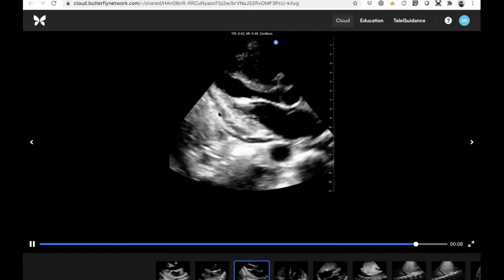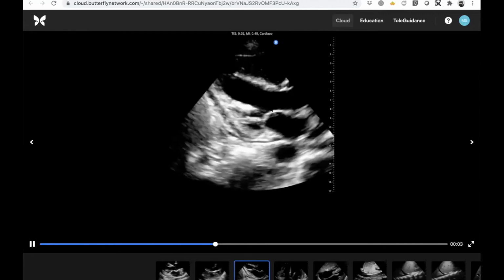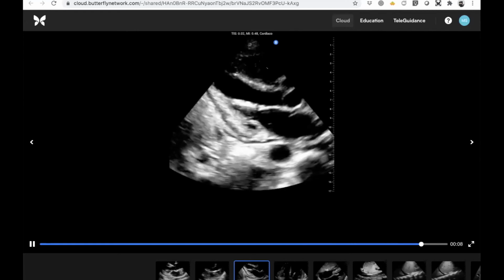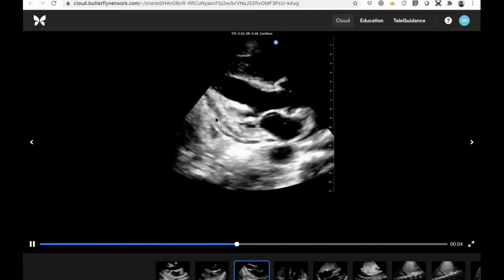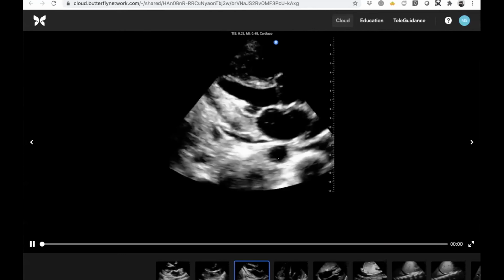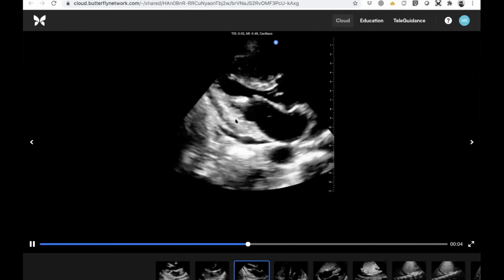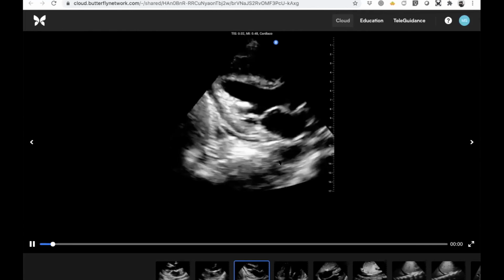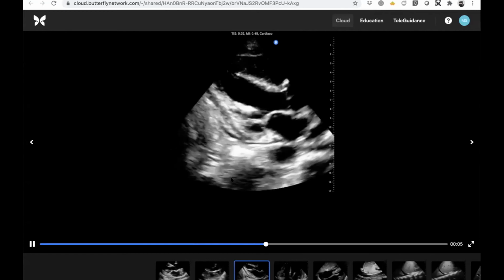Okay, absolutely. So parasternal long axis view, just for participants: left atrium, mitral valve here, left ventricle, aortic valve, aortic root. The right ventricular outflow tract is up here. This is pericardial fluid, so deep to the left ventricle. It's superficial to the descending thoracic aorta, which is here. And that's really how you tell the difference between pericardial and pleural fluid in this image. Pericardial fluid will come around and track superficial between the heart and the descending thoracic aorta, as opposed to pleural fluid, which will be located more out here.